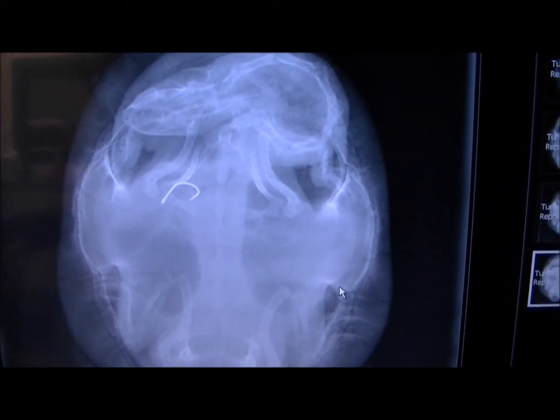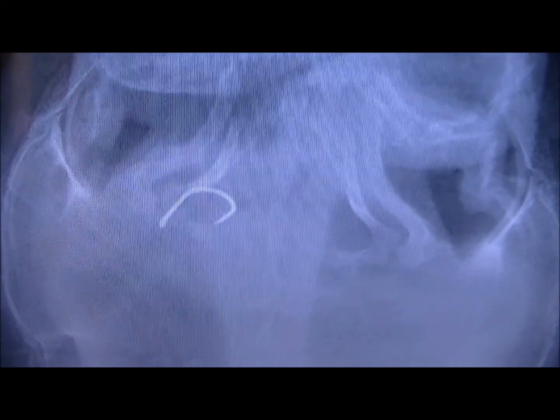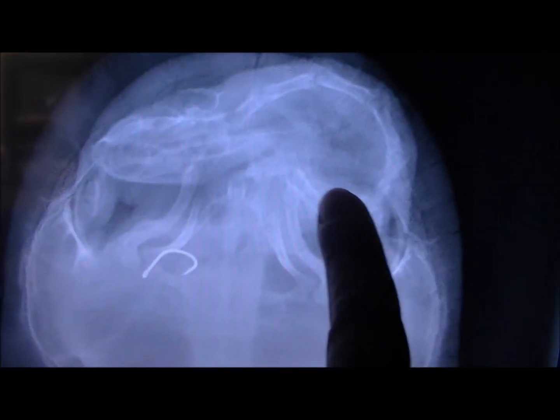So this is the x-ray of our turtle, and it's pretty obvious what's going on here. You can clearly see that fish hook, and it's sitting in the stomach — so it's not in the neck. The neck runs through here, so it's gotten all the way down, and it looks like it's probably sitting in the top of the stomach.